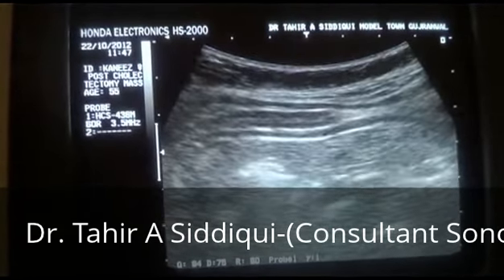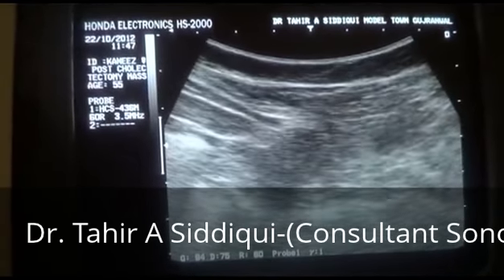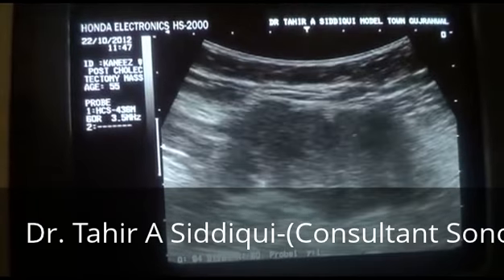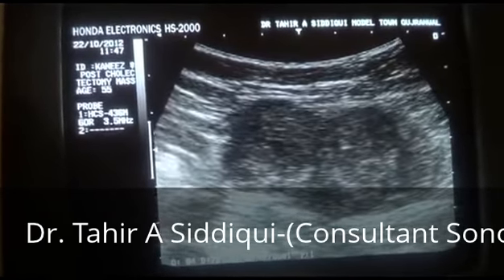Now when I move the probe a bit posteriorly, I see another mass. This is the second one.